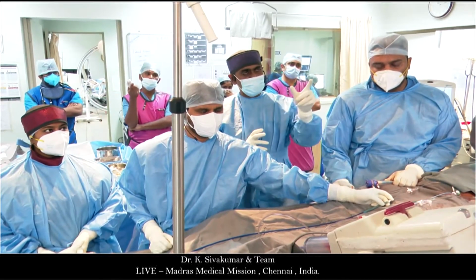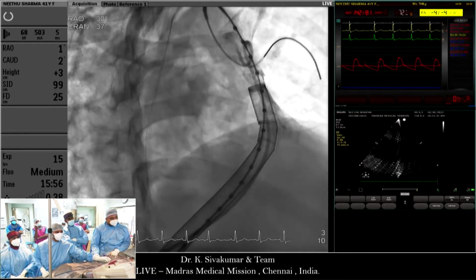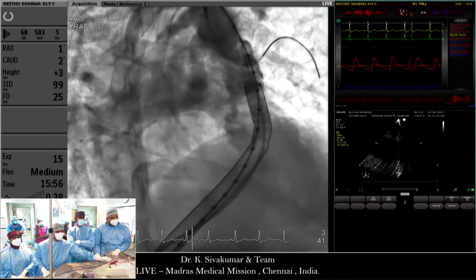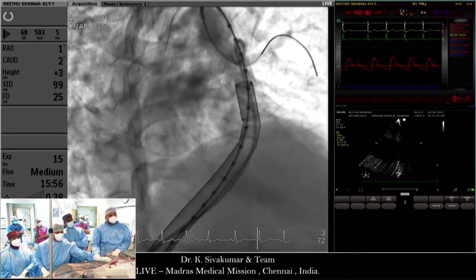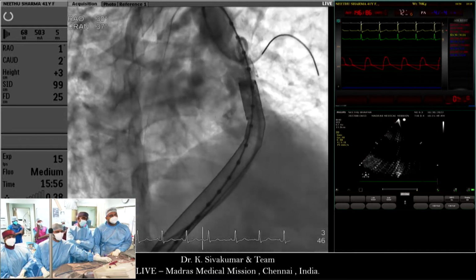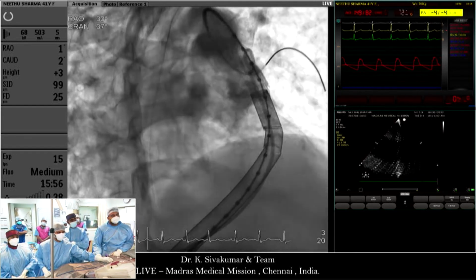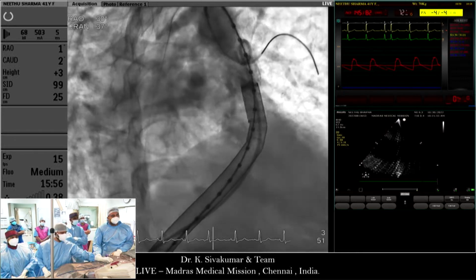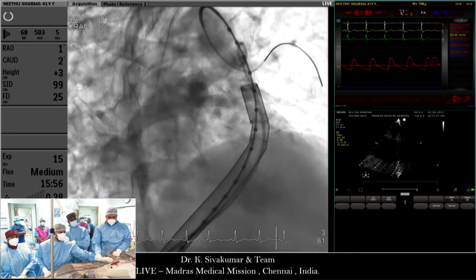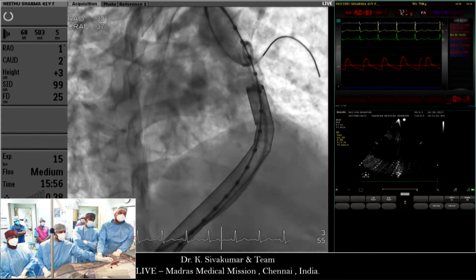I'm going to show 3 angiograms that were done today. We were not able to get the Lundrequist much deeper than this position. I have a venous 24 French long braided sheath, something similar to a Gore dry seal, which has just been made, and this is a prototype. You can see that there is a little bit of kink. However, we have seen in our one previous experience that despite the kink, it works.